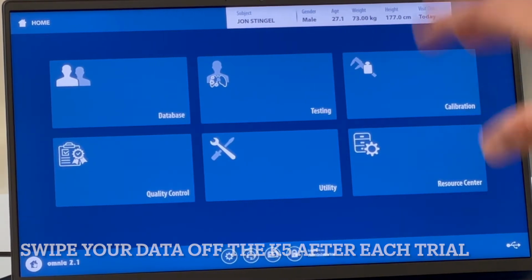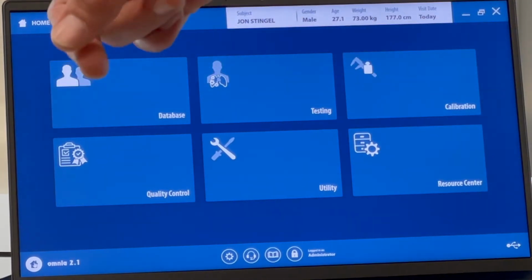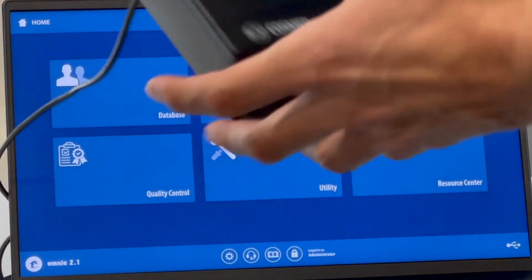Actually, if you're running it through the computer, you'd be fine up until that point, and then it would just cut off, and you would know, oh shoot, there's no more memory left. But if you were just running through that, you'd never know, and you'd be thinking, okay, sweet, I'm getting all this data, and then come back and find no data. So real quickly, let's take a look at that.